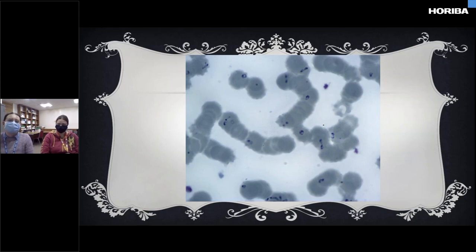Because of the pandemic, the morphology sessions for NEQAS on parasites had been cancelled. So I had a vague idea what parasites looked like in a film, but I wasn't prepared in North Devon for any parasites to turn up. So you start going through what it could be. I made another film because you never know, clutching at straws, it could be stain deposit, and it's obviously not.